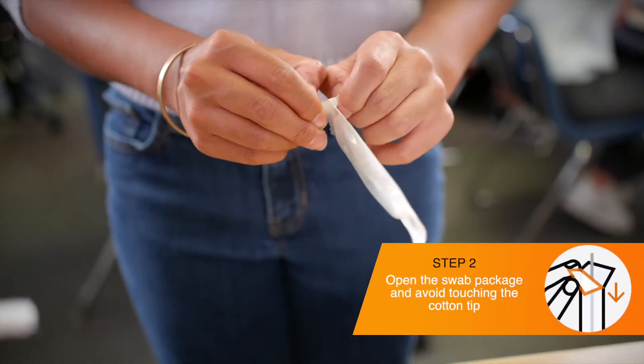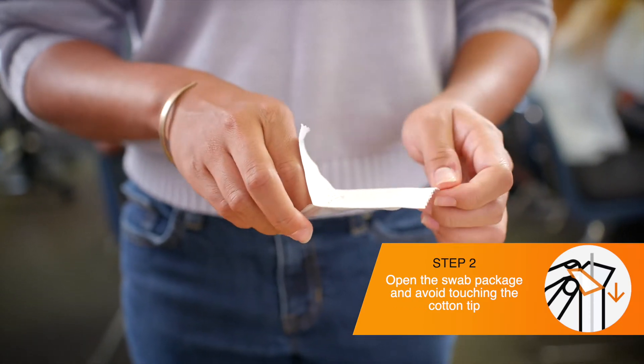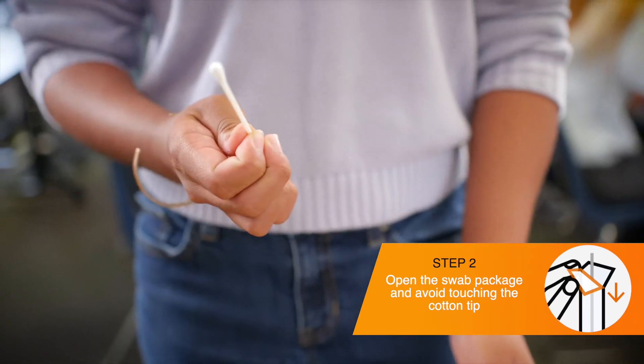Open up the package handle side first by peeling the two layers apart from each other. Take the swab out, being careful not to touch the cotton tip.